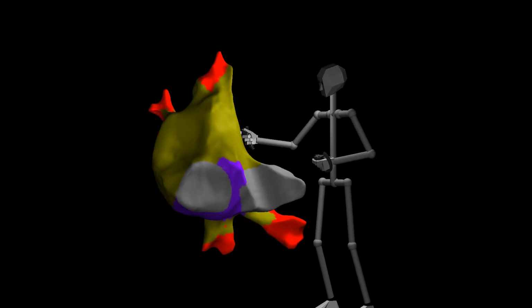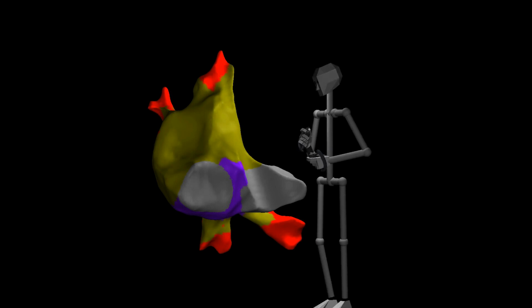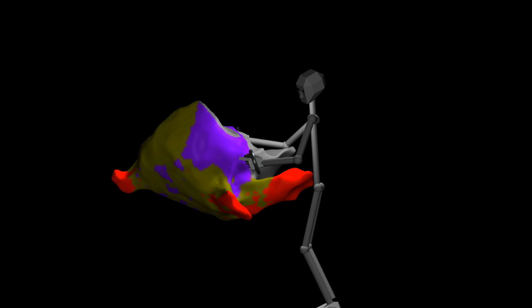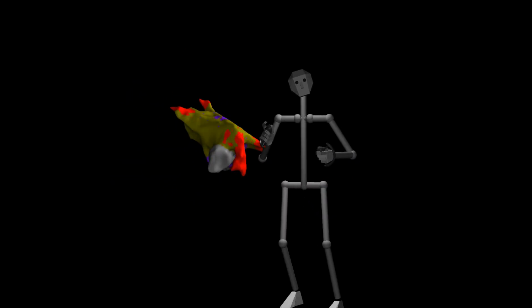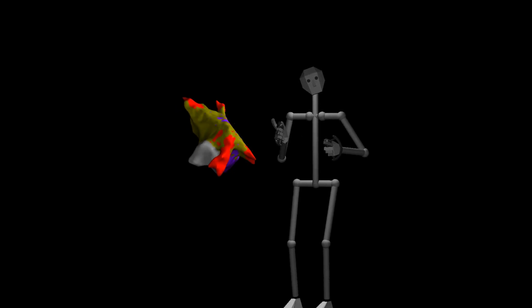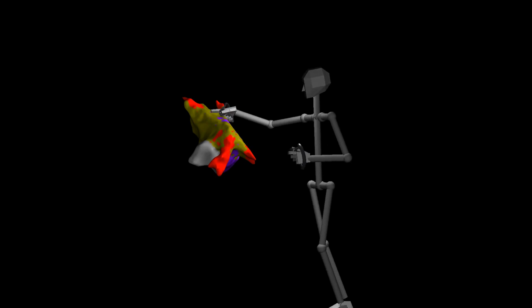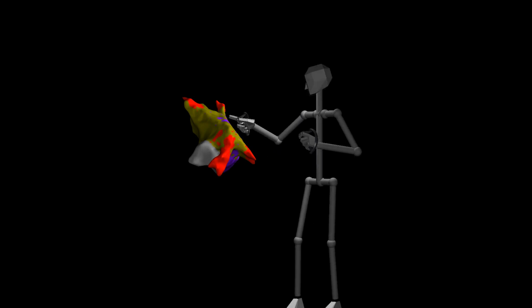The colors on the surface are color mappings of the voltages measured along the surface. So these purple areas here, like this one, and then there's a little bit more purple over here, correspond to voltages of 0.5 millivolt or more. And these red areas here and here correspond to voltages of less than 0.1 millivolt. And then these yellow colors are voltages in between 0.1 millivolt and 0.5 millivolt.